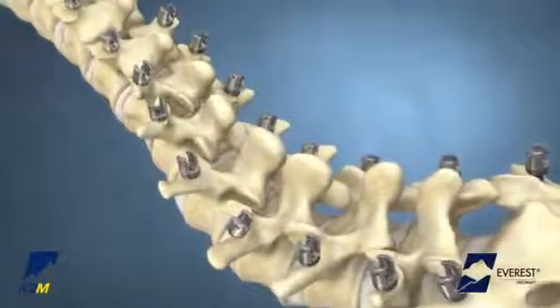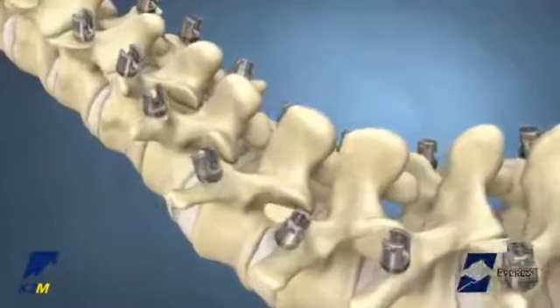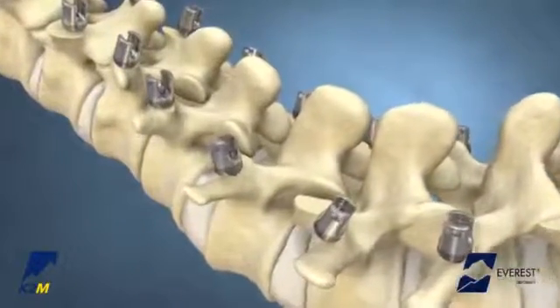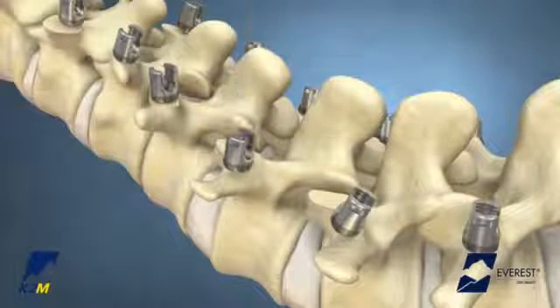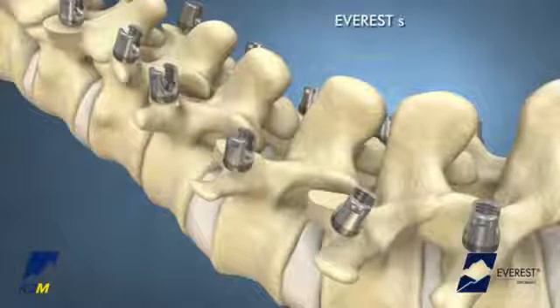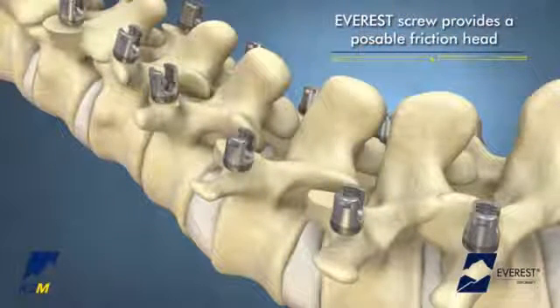Once the Everest screws are inserted, it may be necessary to realign the implant heads prior to rod insertion. The polyaxial or uniplanar housing of the screw can be manipulated with the screw head adjuster. The Everest screw has a posable friction head that will hold position when adjusted with the screw head adjuster.